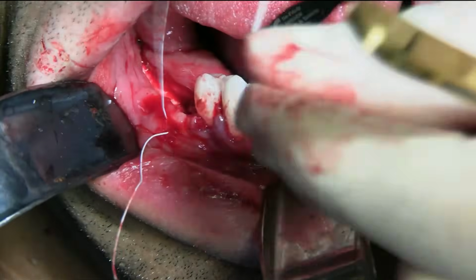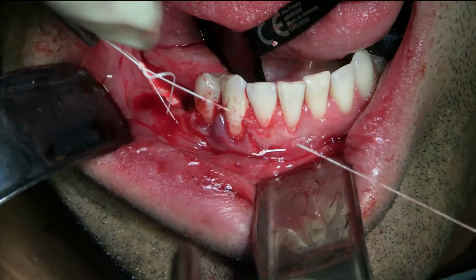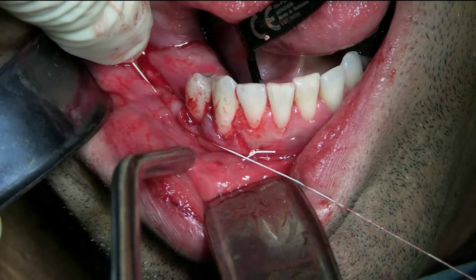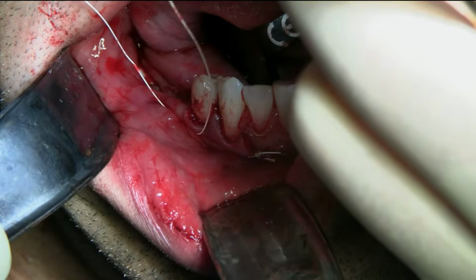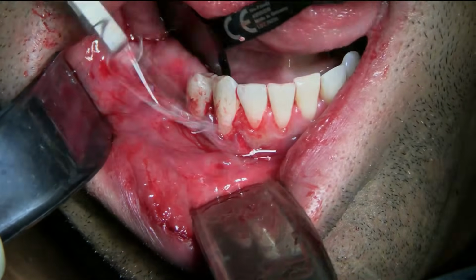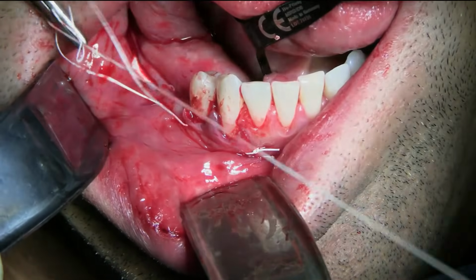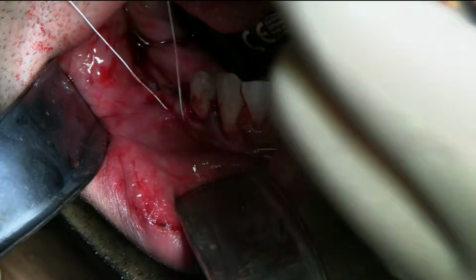Okay. A double throw. Single forward. Single backwards. And double forward.